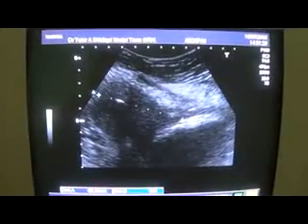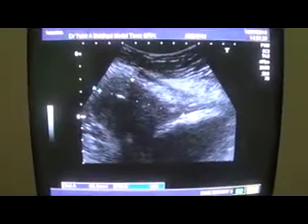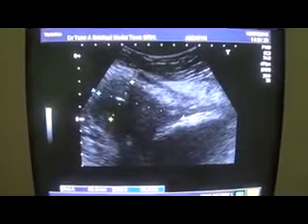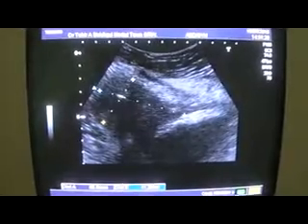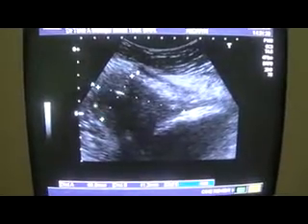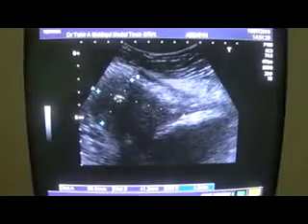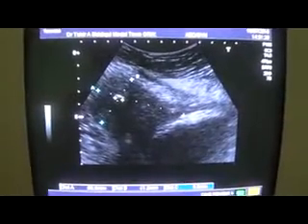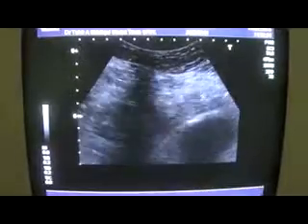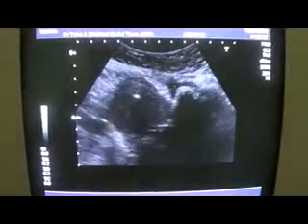This is the uterus measuring 6.89 centimeter by 4.1 centimeter, and at the frontal region you see an echogenic area of approximately 5.8 millimeter, which is within the endometrial canal, which is a bit displaced here.